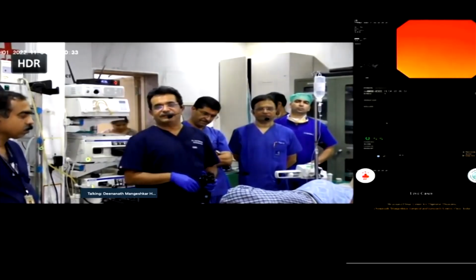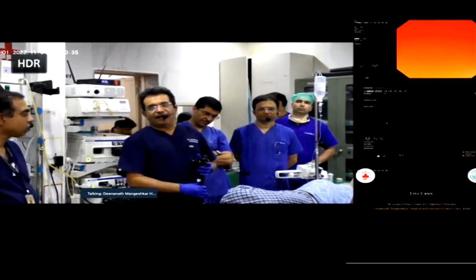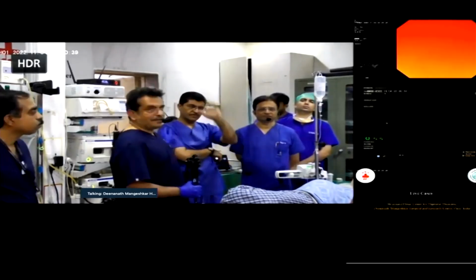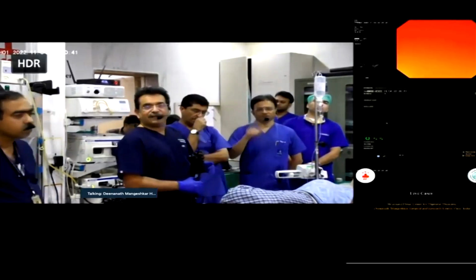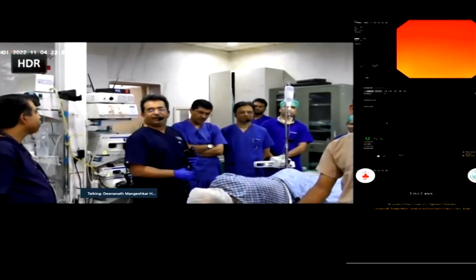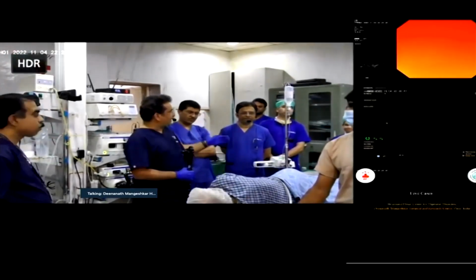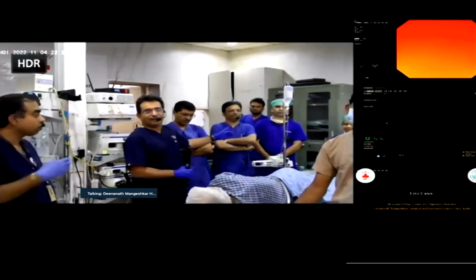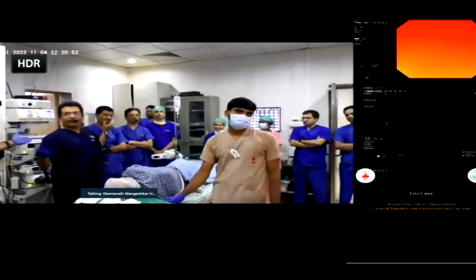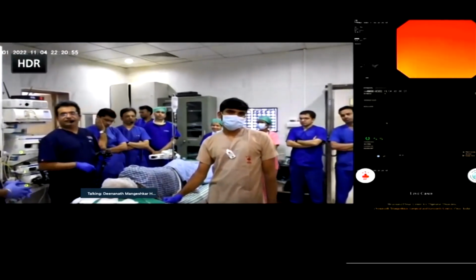From the Shivanand Desai Center for Digestive Disorders at Deenanath Mangeshkar Hospital. I have with me my colleagues, our team, Dr. Harshal Gadikar, Dr. Rajendra Pujari, our fellows and everybody, our anesthesia team, Dr. Amrita Bedekar and Dr. Sagar Bandishti, and our entire team over here.